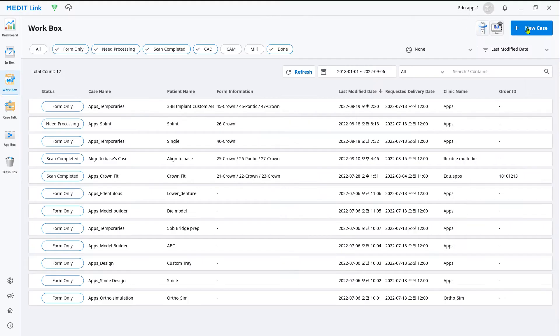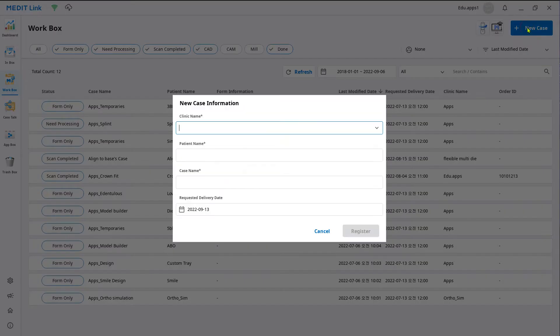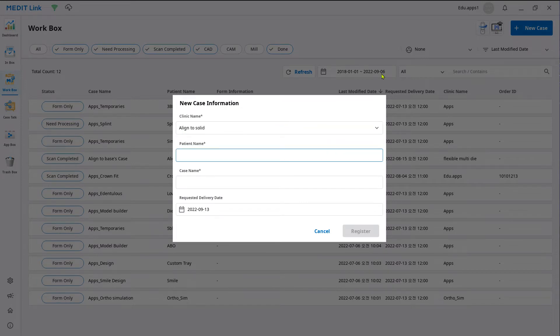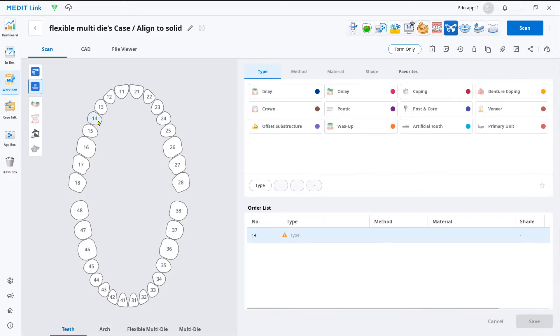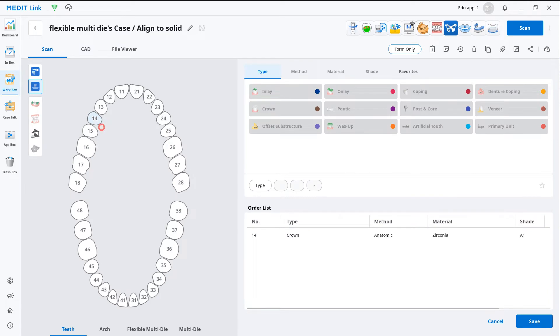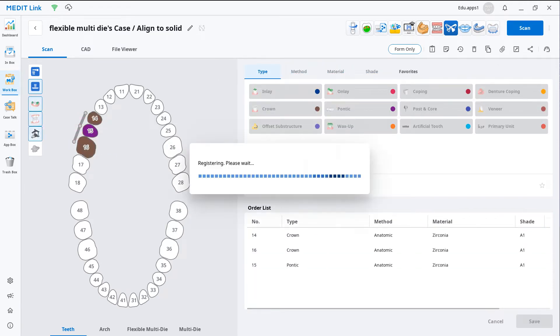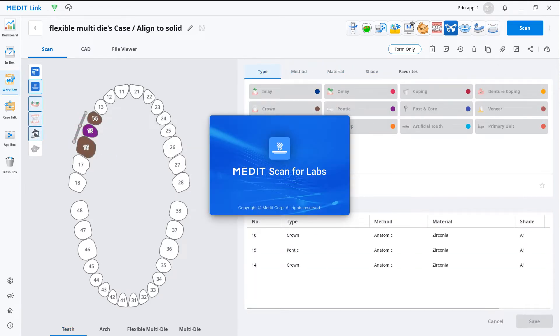Create a new case in the work box. Enter the clinic and patient's name. In the case detail window, select the restoration information according to your work and click scan.